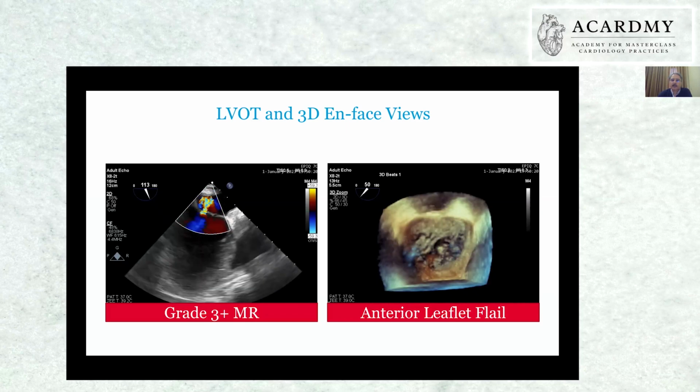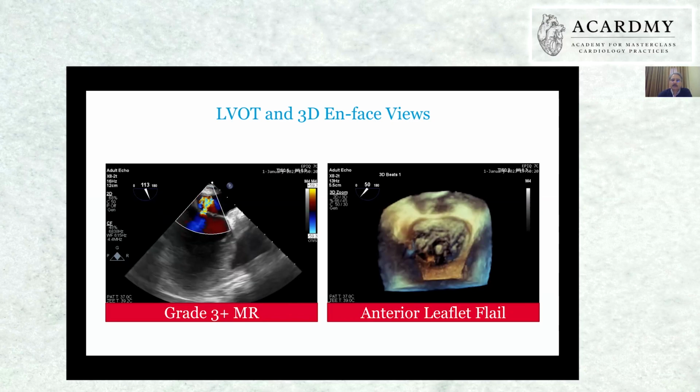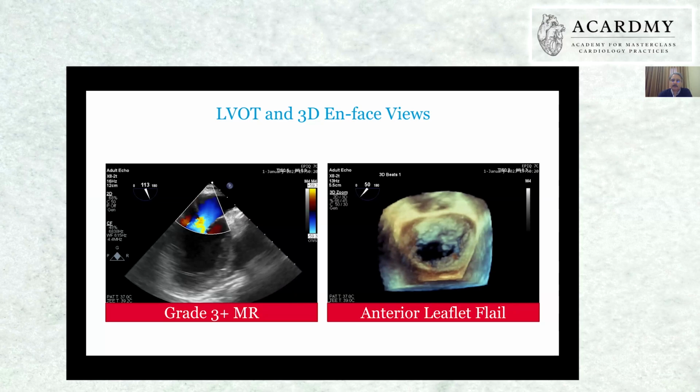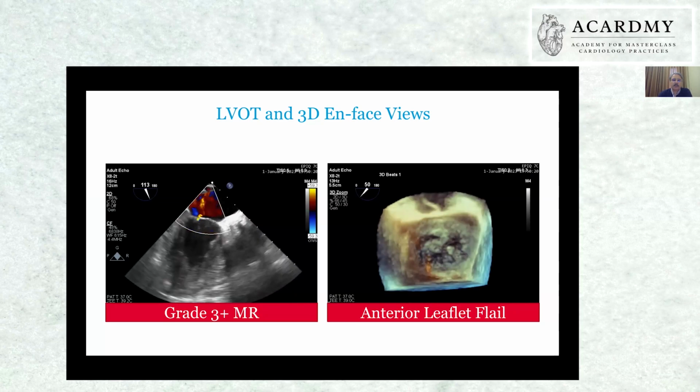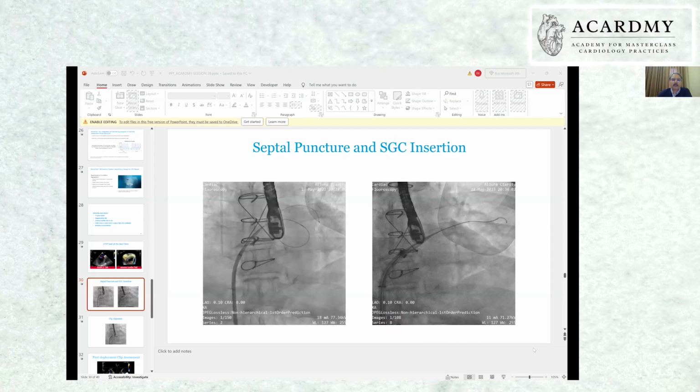It is visible. I think you can decipher. If you see clearly, there is one component of the anterior mitral leaflet which is flailing into the LA and causing this MR. That is the A3 component. So now we know we need to catch hold. So we are back. Sorry, interatrial septal puncture is the key point, and that has to be very precise.